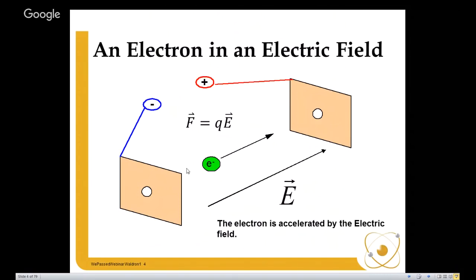We just need to find a way to create this electric field at the field strengths we want so that we can accelerate electrons to millions of electron volts. And therein is where the technicalities begin to overtake us.